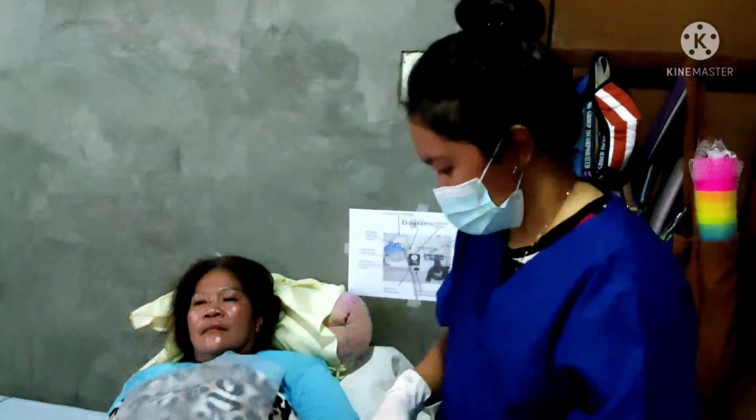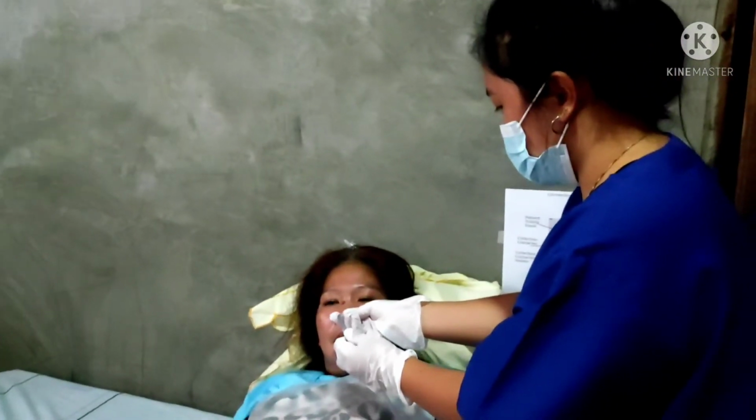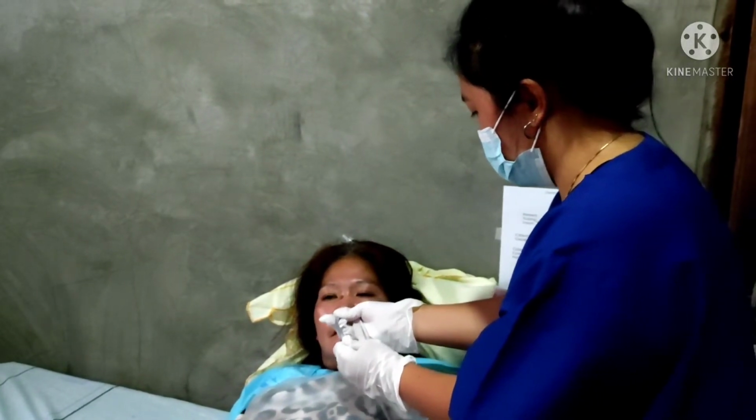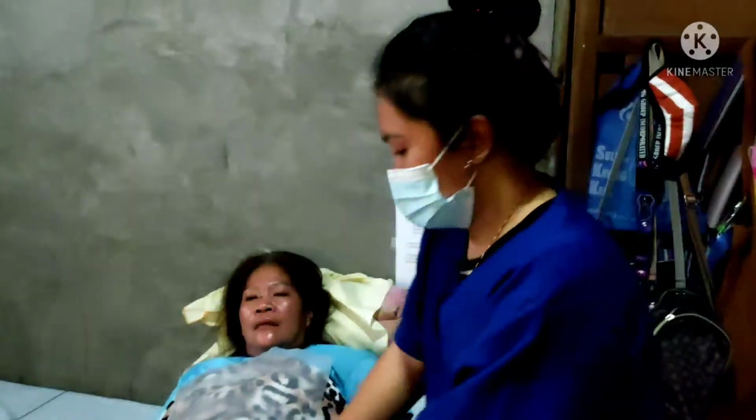Then encourage the patient to cough. Replace the oxygen device and instruct her to inhale deeply.